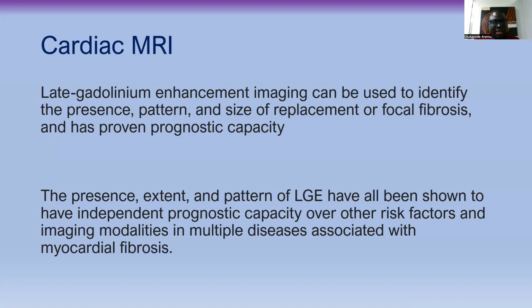So now, this is done within 10 to 20 minutes of image acquisition. After injecting the gadolinium or the contrast agent, within 10 to 20 minutes you begin to see the signal. The early signal you see has some clinical implications, and the late signals you see have some clinical implications. And this is where the late gadolinium enhancement comes in. It is late because we look at how much of the myocardium retains this gadolinium.